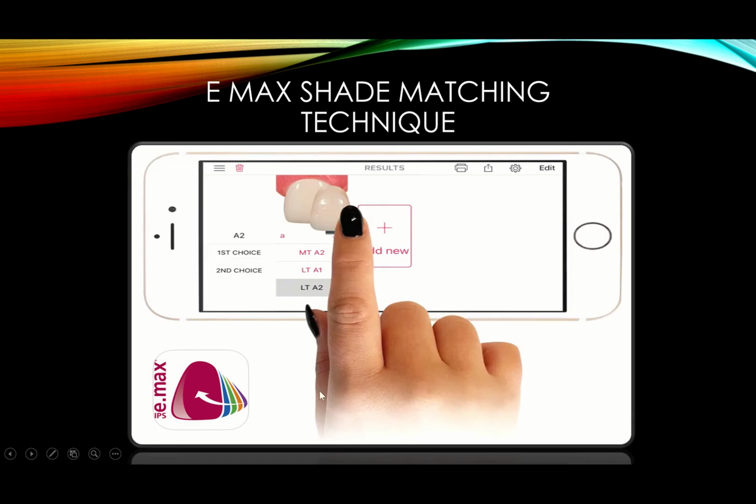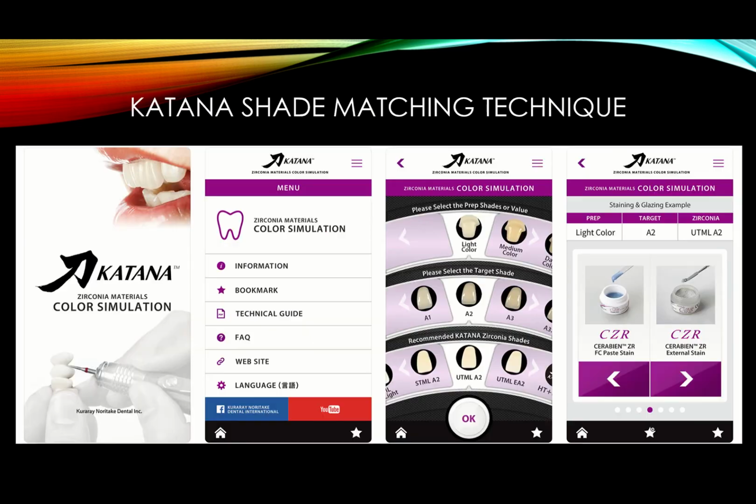So, in other words, first choice it will suggest MT, medium translucency, A2 ingot, for example. And then second choice would be LT A1 ingot. And then the last choice, if you really have to, you can go with LT A2. All right? It's pretty precise. It works. Same thing from Katana, Noritake, Kuraray.